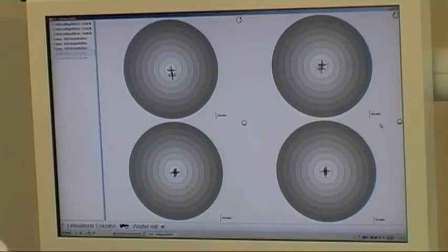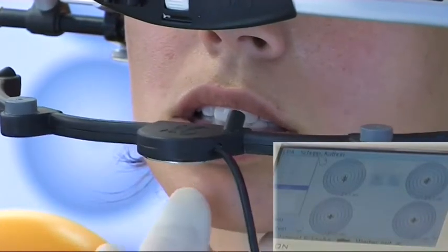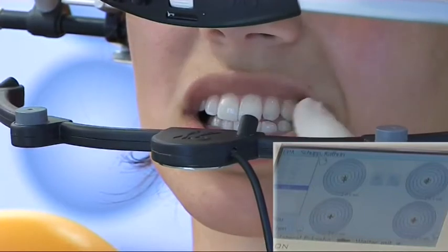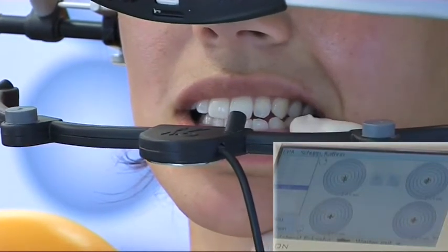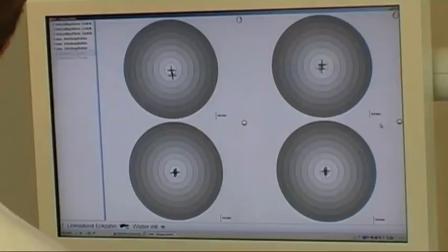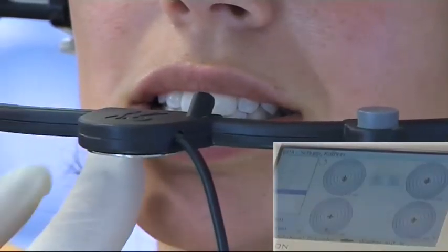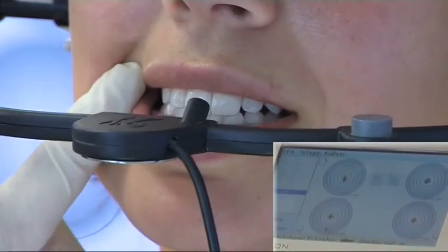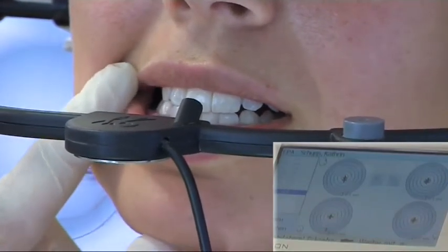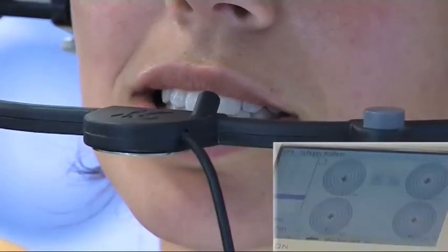With tooth contact, the patient moves to the left as far as the canine. We see that the canine tips are just colliding; the patient is guided slightly back and instructed to lightly hold the bite. The measurement is started. The patient then moves backwards and under tooth contact to the right, remaining on the canine tips, and stops. The measurement is completed.